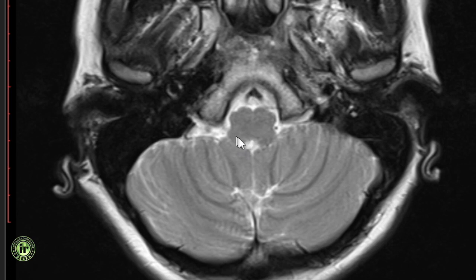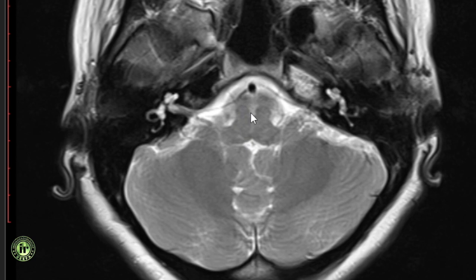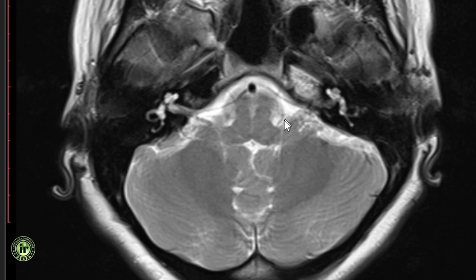On either side are the fasciculus cuneatus and gracilis transmitting the posterior column fibers. More cranially, the posterior eminences become more prominent, forming the inferior cerebellar peduncles. The dorsal surface of the medulla becomes the floor of the fourth ventricle. Along the lateral aspect, the fourth ventricle communicates through the foramen of Luschka with the cerebellopontine angle cisterns. This is an important pathway for the spread of intraventricular tumors into the subarachnoid space.